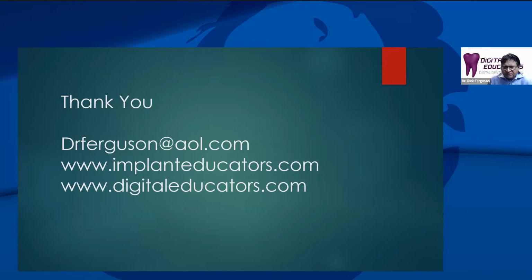So I did use some cell phone apps early on. And here's the thing, I don't believe they are going to be as accurate. Will they work for certain cases? Sure, it depends on what level of accuracy you're looking for. If you notice all of these face scanners that I showed, they have several lenses and they're far apart, which you're not going to necessarily get with a cell phone.